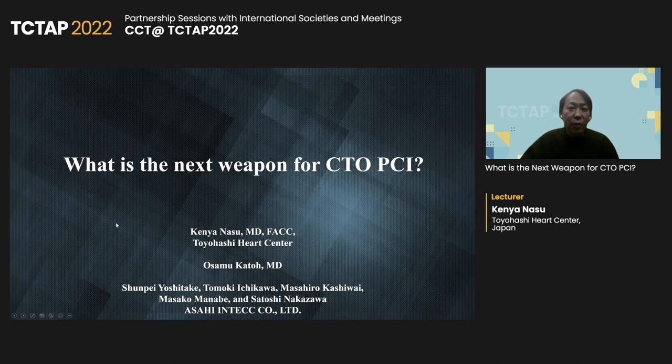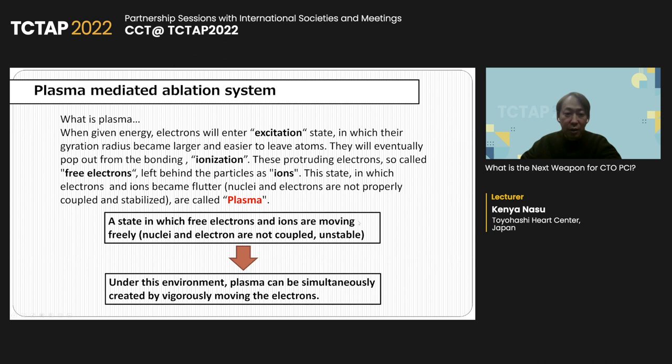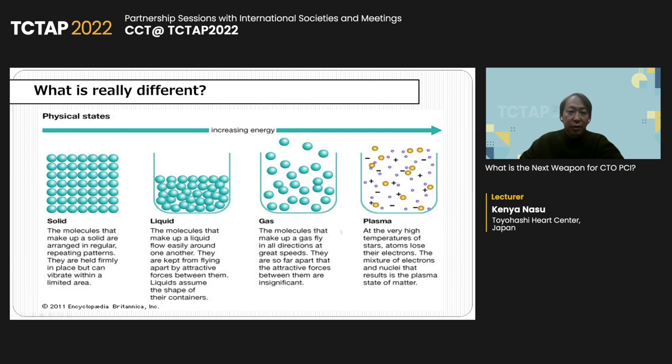So I want to talk about the plasma-mediated ablation system as a next weapon for CTO-PCI. In this presentation, all of the new medical devices are not approved all over the world, but the logic is based on a mathematical strategy. The plasma has a high energy. We can explain the plasma in this slide.